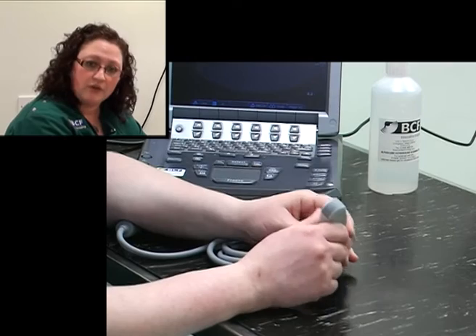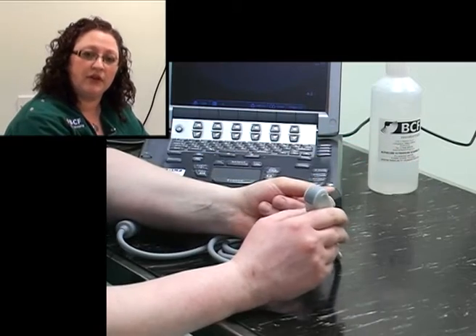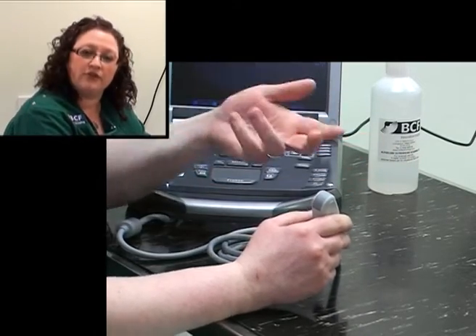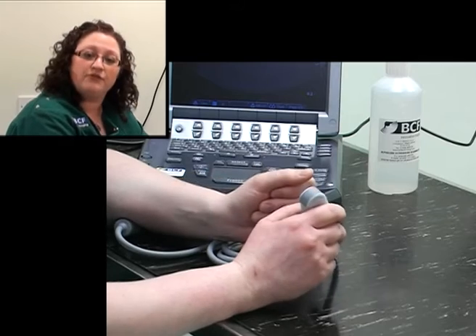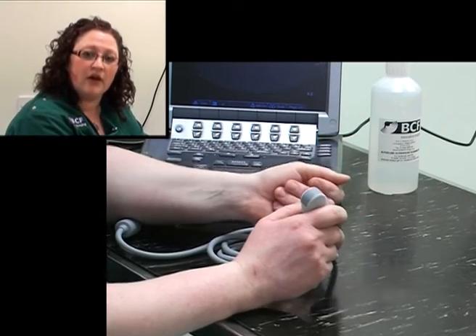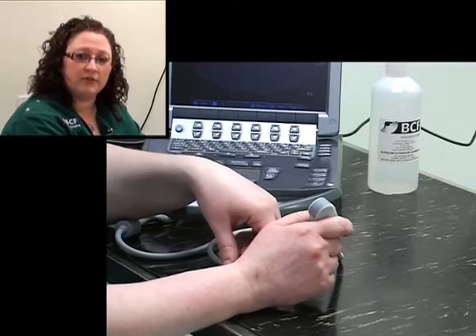Conversely, a lower frequency will not give as great detail, but is able to penetrate much further. So even in one particular animal, things that are closer to the surface that you want to look at, you can use a higher frequency. And for deeper structures, say deep within the liver parenchyma itself, you'll want to use a lower frequency. This is something that can also be changed on the machine.